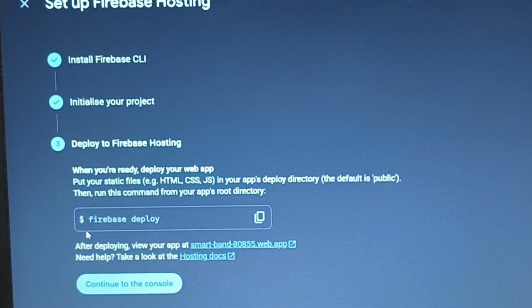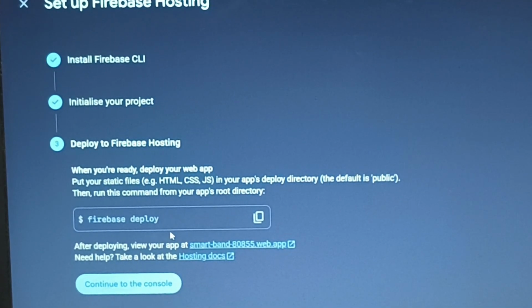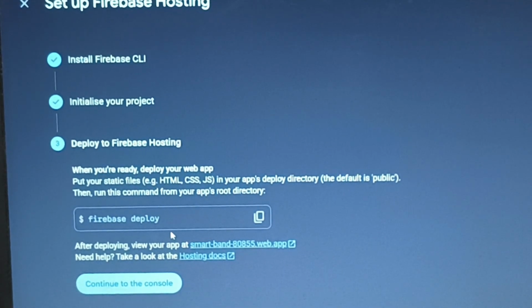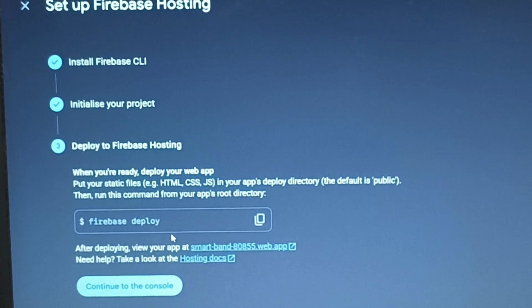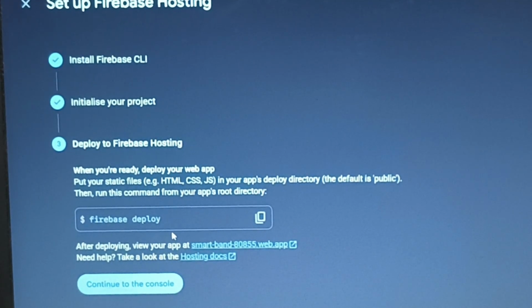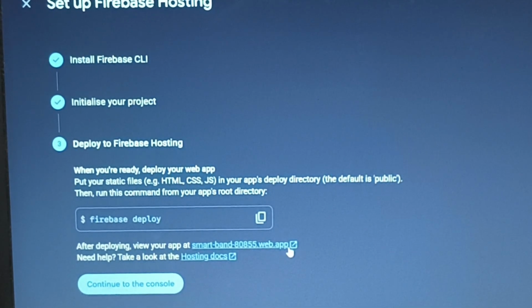And then when you're ready, the HTML and JavaScript file should be present in the folder where you want to deploy your project or host your website. And then you will run Firebase deploy, and it will deploy the whole HTML and JavaScript, so you can access your hosted website from anywhere. And this is the link of your website when it gets deployed.